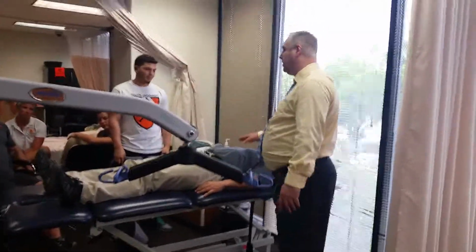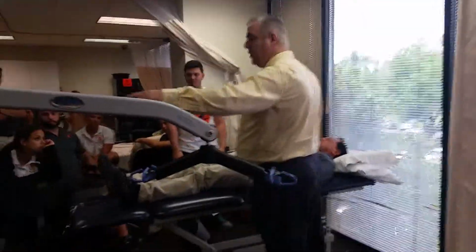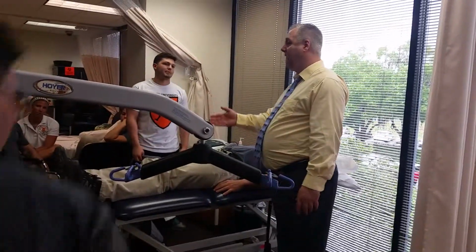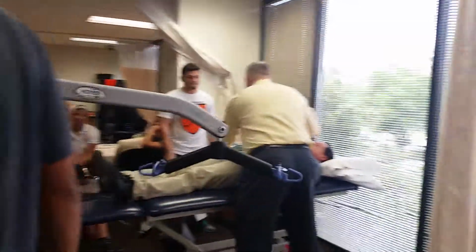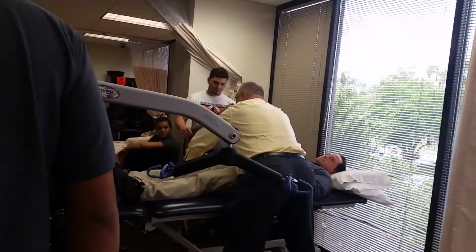So we're actually going to take him from the bed and we're going to transfer him to the wheelchair. We're going to put him in that wheelchair. Okay. So doctor's orders said patient out of bed to chair. That's our orders. Okay. So I'm going to come over here and I'm going to basically have to do all the work myself, so I have a hold of him.